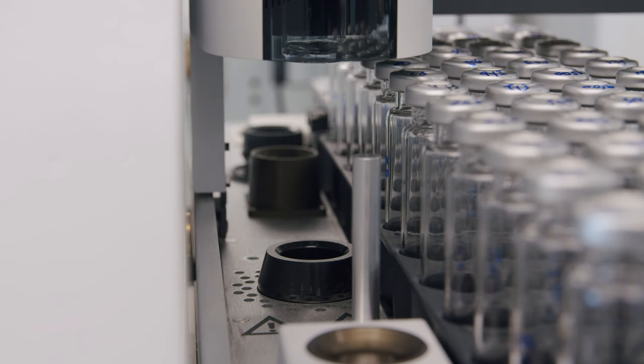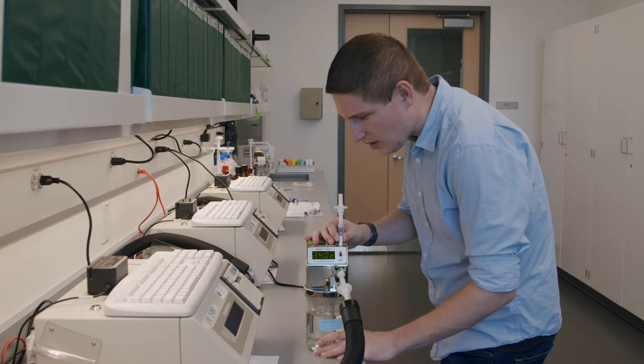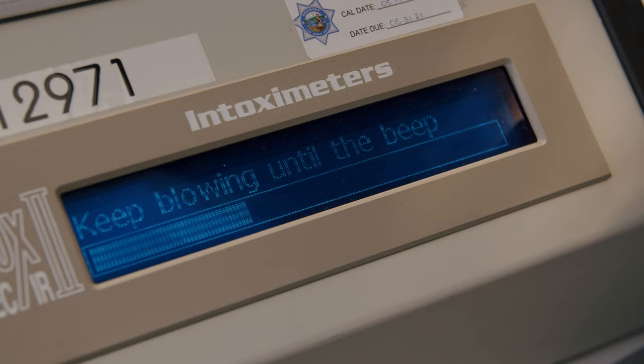Right now, we're in the breath alcohol room, and this is the room where we calibrate and maintain breath alcohol instruments that are used in the county. When a person blows into the breath alcohol instrument, there are two components at work. The first is the infrared detector, which monitors the quality of the sample that's being provided to the instrument. Secondly, a small portion of that person's air enters the electrochemical fuel cell, where the alcohol in the person's breath reacts with a catalyst inside the instrument to produce an electrical current. And that electrical current is proportional to the amount of alcohol in the person's breath.